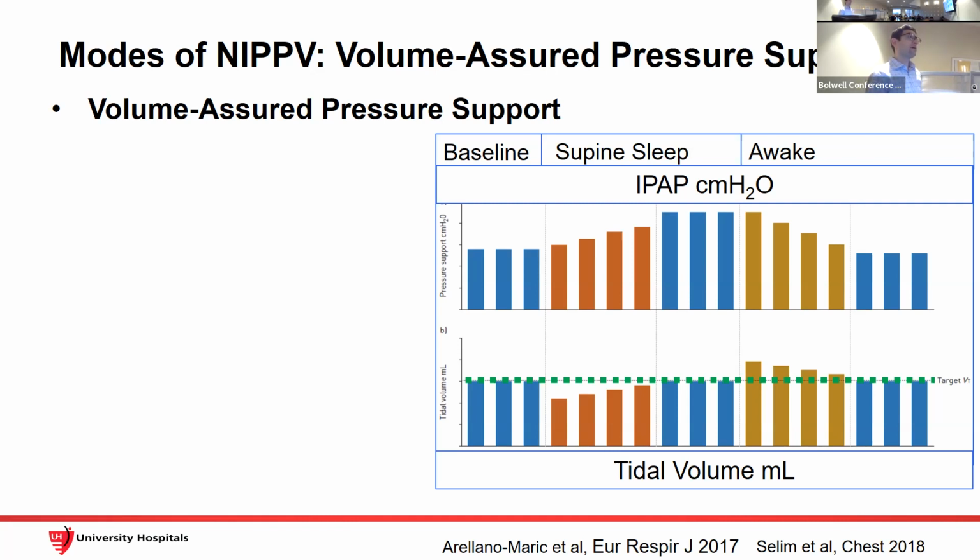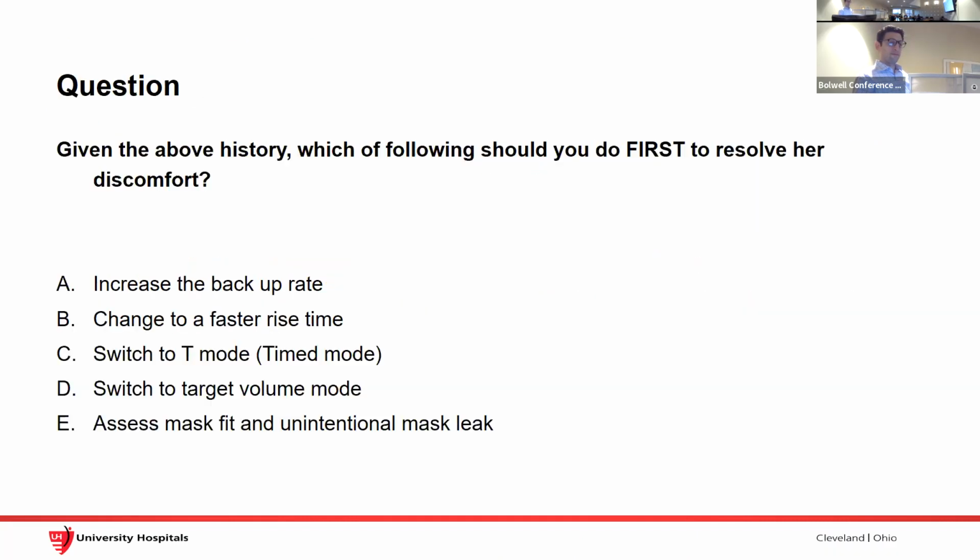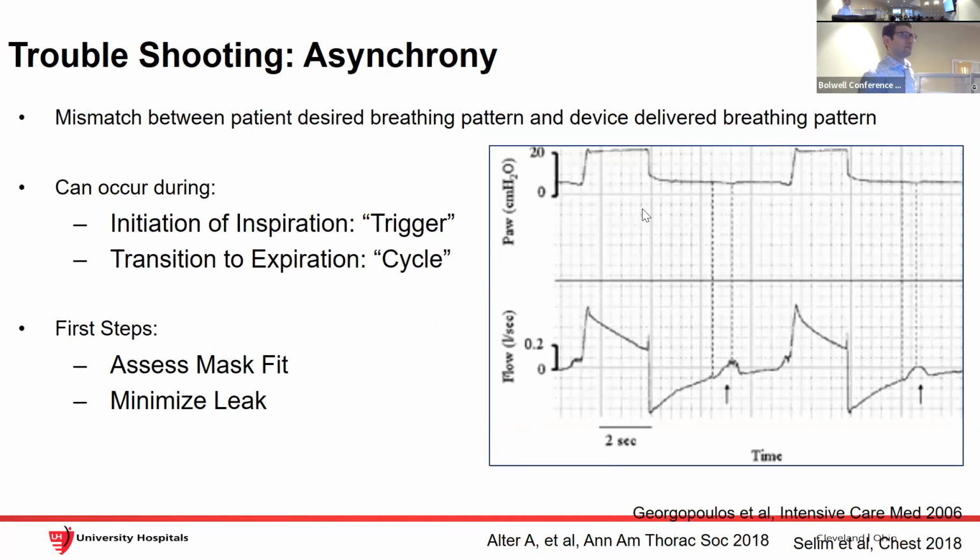And so they were saying that that's what it is, and since there was no patent on PAP, there should be no patent on bilevel, right? So there was a lot at stake at that particular time. What that does though is it triggers and the flow goes up, and the flow reflects the compliance of your chest wall, your airway size, how your upper airway is working, the whole sort of thing.